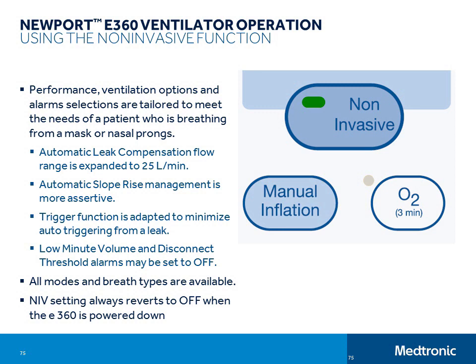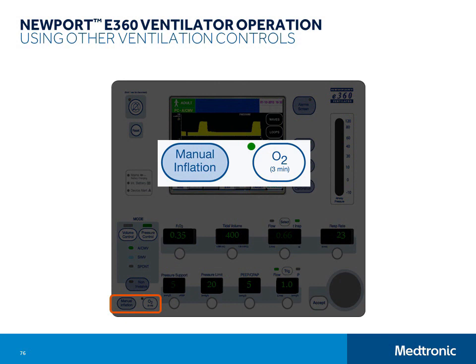There are two commonly used controls found on the control panel in the left lower corner: the manual inflation button and the O2 3-minute button. To perform a manual inflation, push and hold the manual inflation button, then release the button to end inspiration and allow exhalation. To initiate a 3-minute O2 function, which delivers 100% oxygen to the patient for 3 minutes, just push the button. This button has a toggle function — to end the 100% O2 delivery before 3 minutes have elapsed, you can push it again. It is lit when active.